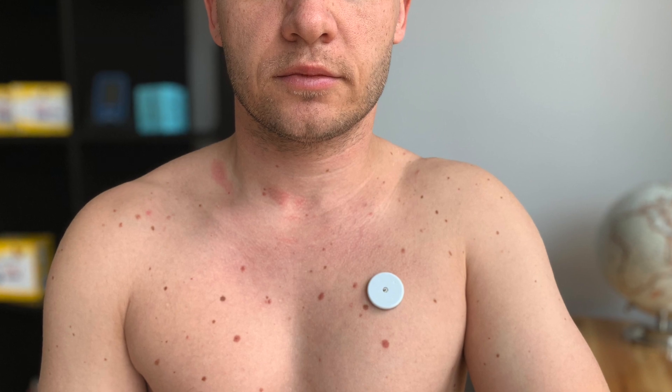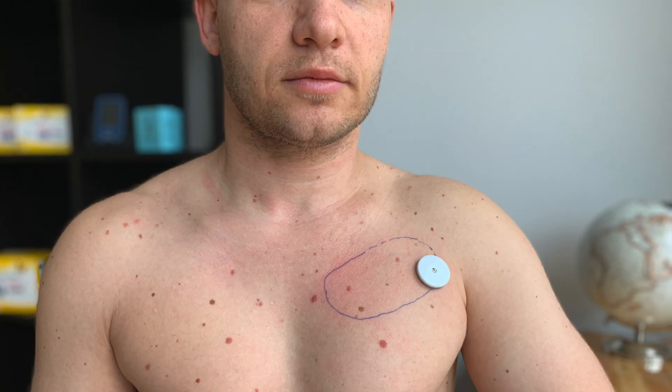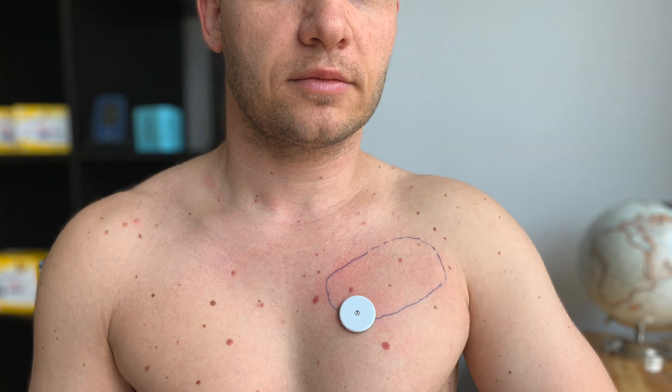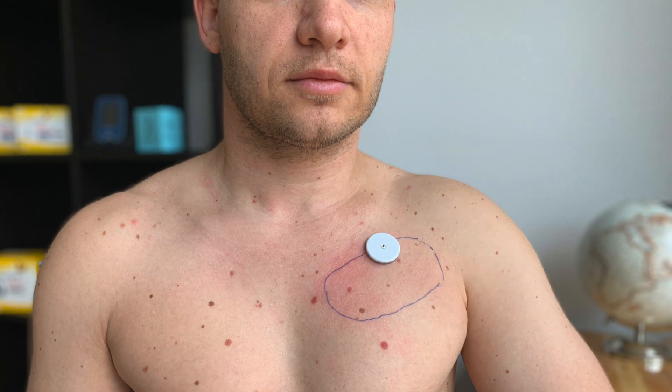Category number 1 is placement. I have the sensor 2 to 3 inches or 6 to 8 centimeters from my armpit and about 2 inches or 6 centimeters from my collarbone. The range where you can place the sensor on your chest is quite big, so try it out and see which spot is the best for you. This is the area where I would be generally comfortable inserting the sensor.